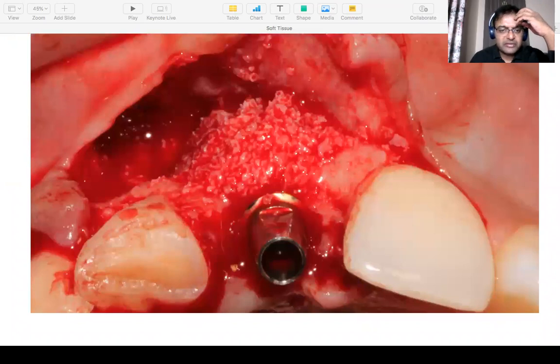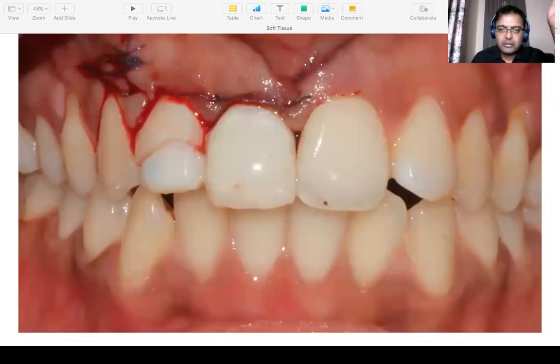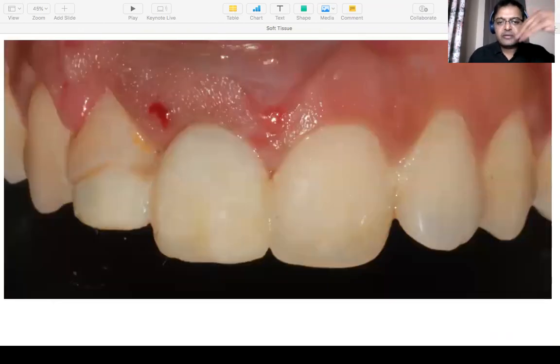We did an implant first, then a bone graft, contour augmentation. It's not for hard tissue, but for soft tissue. Graft around, temporized. Temporaries always, if your implants are rock solid stable, if they have an insertion torque of more than 35, you can always load them with temporaries. Especially in the aesthetic zone, when you make a good set of temporaries at the tissue level, you start building up the soft tissue from day one. On the day of implant, you start building the soft tissue.